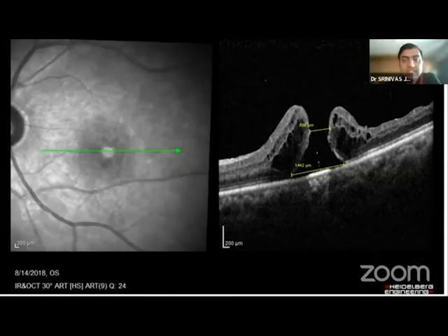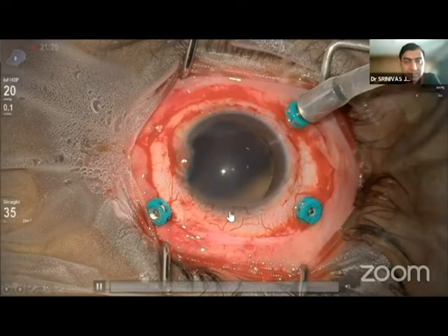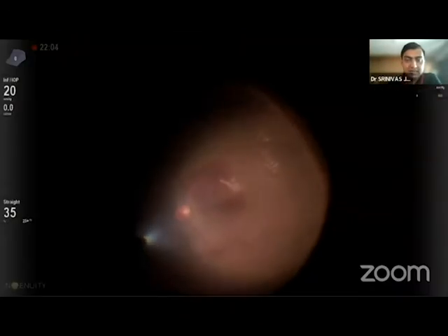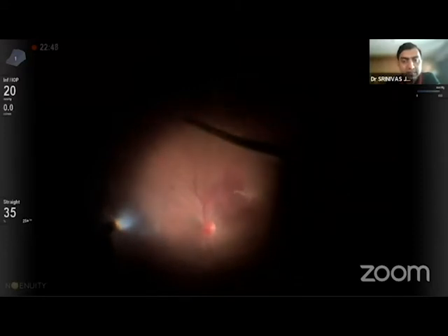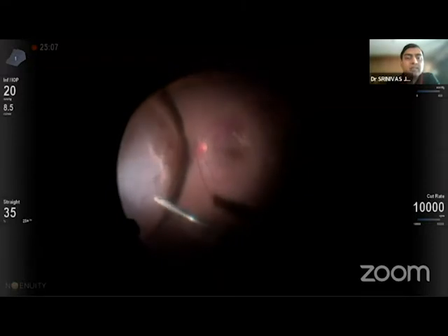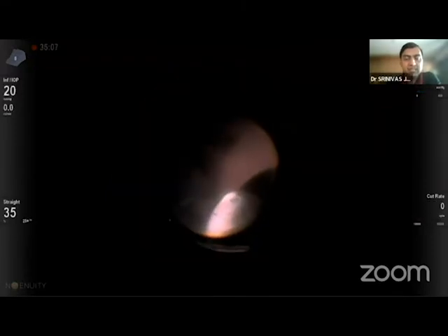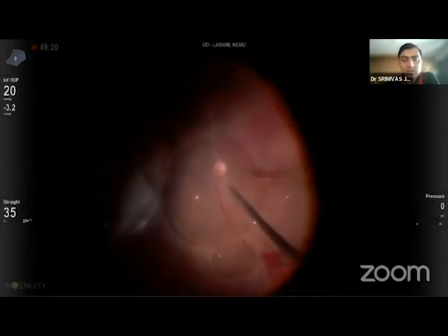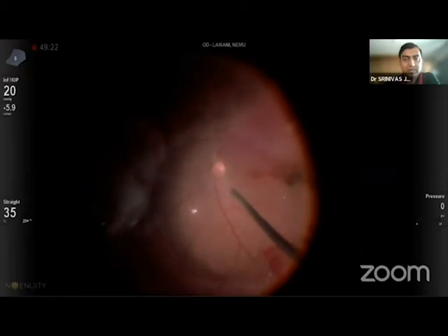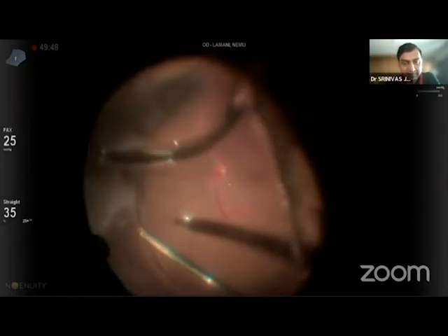So this was the next case. He's a police constable who got hit accidentally in a lathi charge. Here there was a nasal RD as well, and you can see a small thin film of blood over the macula. So I thought, anyhow I was inside, let me do a subretinal TPA as well.